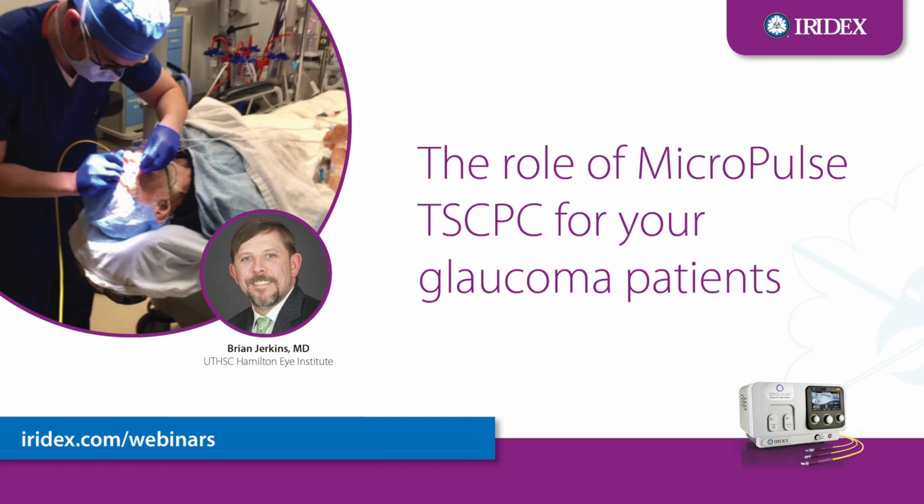Even with patients who had significantly high pressures, there were instances and a real concern that you could get a hypotonous patient. And I've just not had that with MicroPulse long term. Do you avoid the 3 and 9 o'clock meridians when you treat? I really try to. I think that still is the one thing that is very much a concern with this, and it's very easy in some patients to almost lose your landmarks a little bit. So I do try to avoid 3 and 9 o'clock as much as possible.